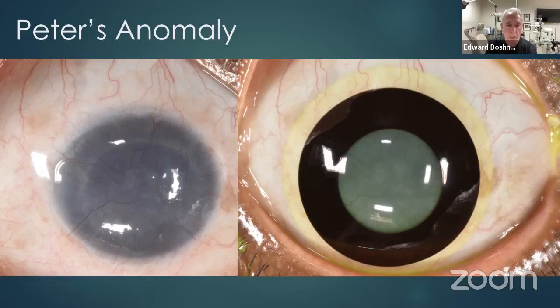And to give her a pupil, we fit this eye with a blackened soft lens. We gave her an 8mm clear pupil, and over that we put a scleral lens. So with the blackened soft lens and the scleral lens, the patient has 20/80 vision. Without this scleral lens, soft lens combo, the patient's visual acuity is basically hand motion. This is her only eye. She lives by herself also. And she has a job now. She works in a nursing facility and empties out the trash and does menial work, but she has a job.